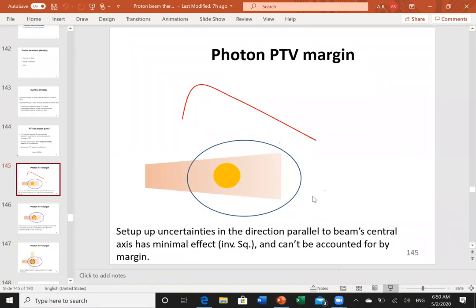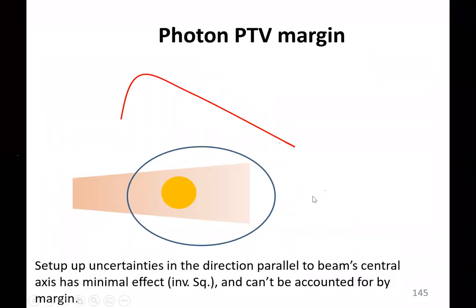Yeah, another question. If you remember in your discussion about the advantages and disadvantages, one of the advantages of the PBS, that is pencil beam scanning, was increased lateral penumbra as compared to passive scattering. But there is also somewhere that you said that with the pencil beam scanning, you can actually reduce the dose to the distal edge of, let's say, the tumor. So those two points were contrasting.